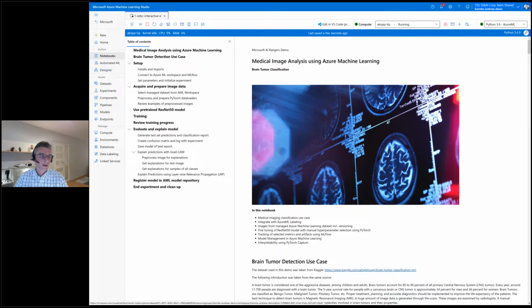And on the other hand, I have those assets that are critical for, let's say, collaborative workspace where I want to work together with my coworkers, and we want to jointly work on version data sets. We want to track our experiments and the resulting assets of such experiments like models. And then we have also the compute infrastructure that we are leveraging, and also labeling capabilities, which we are going to take a look at a little bit later.